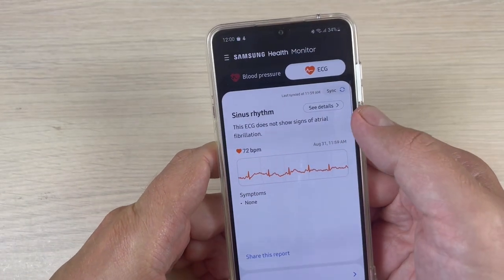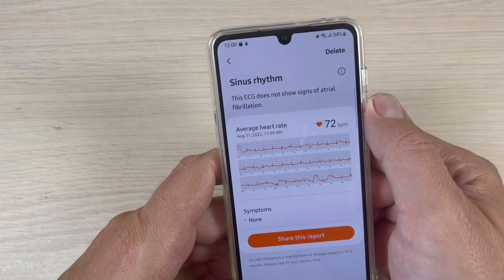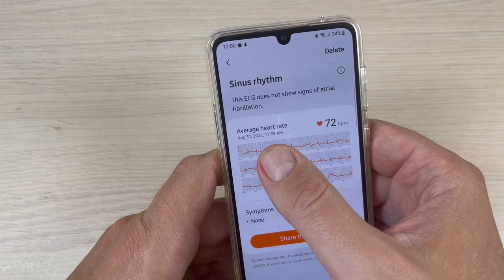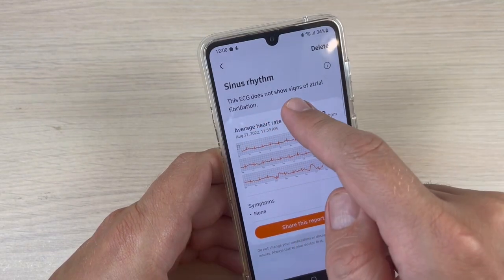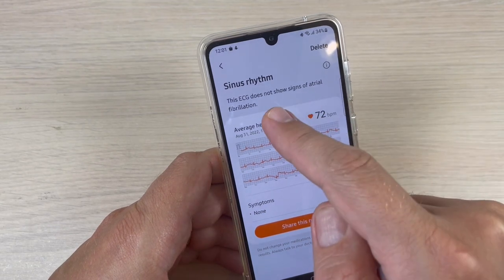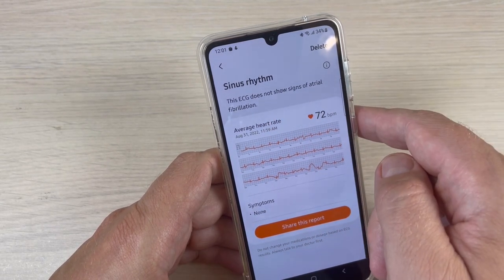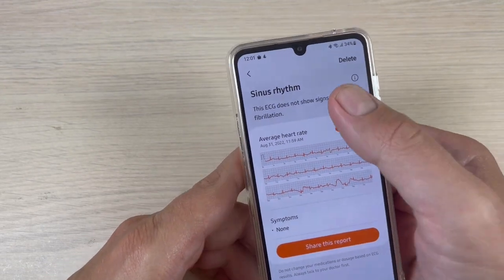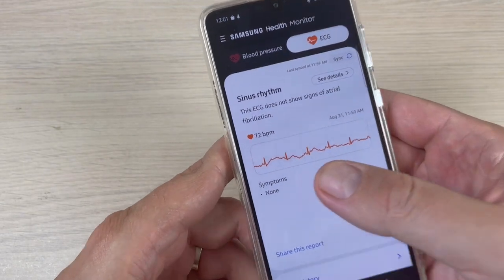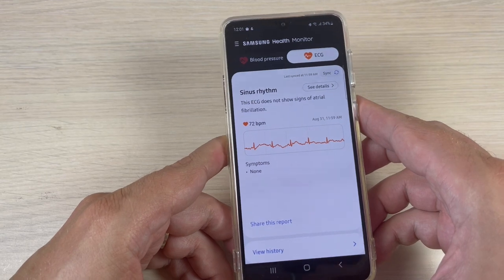And here we have also the results on the phone. You can press 'See Details' and here is the average heart rate: 72 bpm. Everything is okay because this ECG does not show signs of atrial fibrillation. Here you can share this report if you want, and symptoms show none.